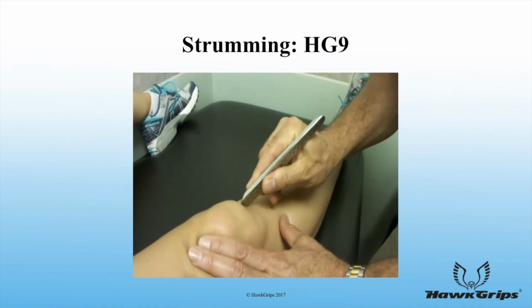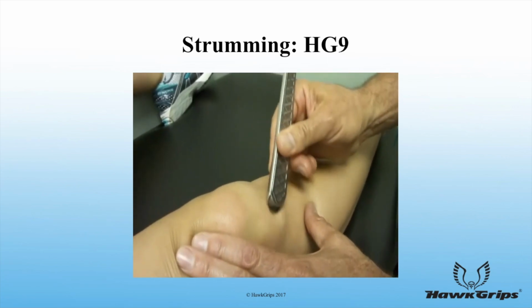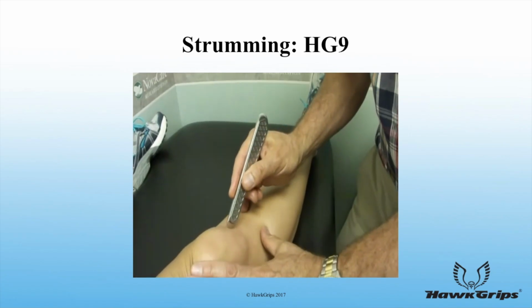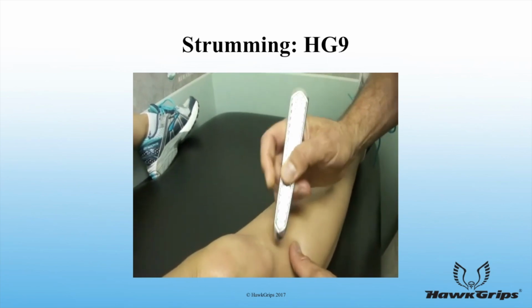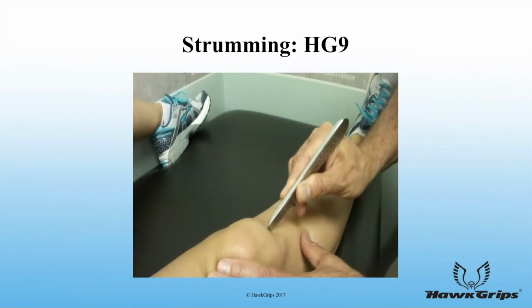The instrument angle can approach 90 degrees, usually held around 70 degrees to the patient's skin. While the instrument engages the tissue, treatment remains in the direction of the bevel as with the other strokes. This stroke is particularly effective over tendon and ligamentous tissue.